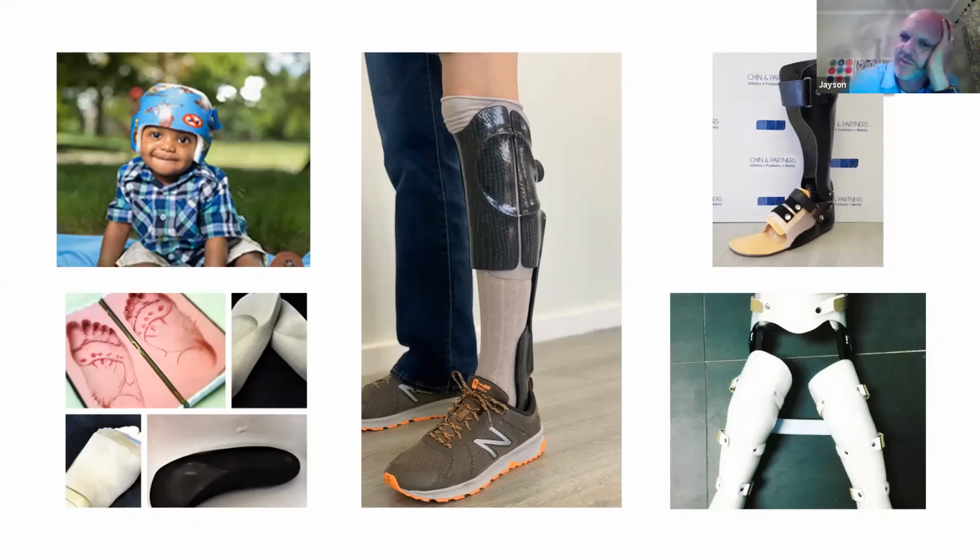This is a dual system brace where you'll see that the inner foot piece is a flexible plastic that can immobilize the foot in whichever position is going to be best for that patient, but it allows you to then lock the foot back in the brace. And then down at the bottom, we've got a big custom-made, it's probably a Perthes brace with the strut holding the legs in abduction. We've got hip joints and a whole pelvic girdle. So really, we can follow whatever prescription within reason that the orthopedic surgeon provides us with, and there's generally a brace that can support that or that part of the body, whatever it may be.